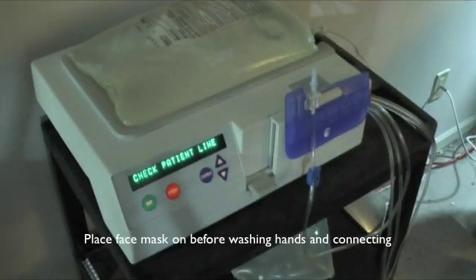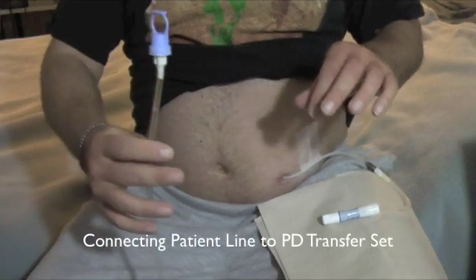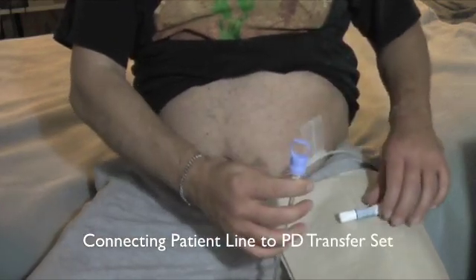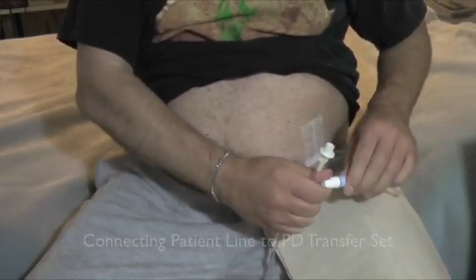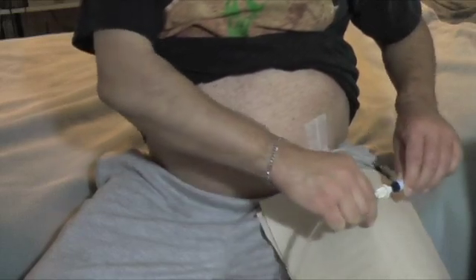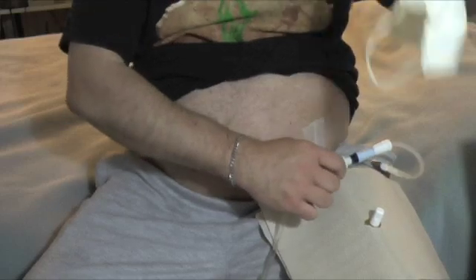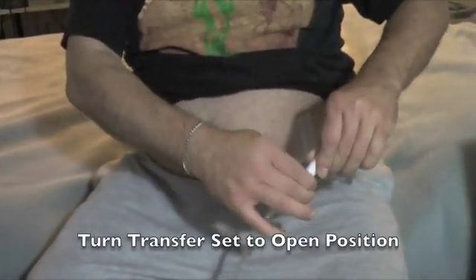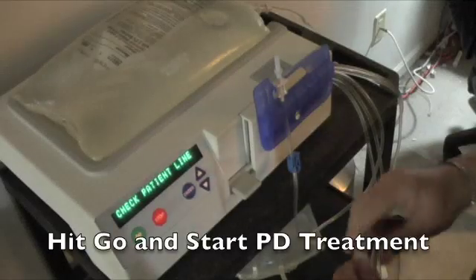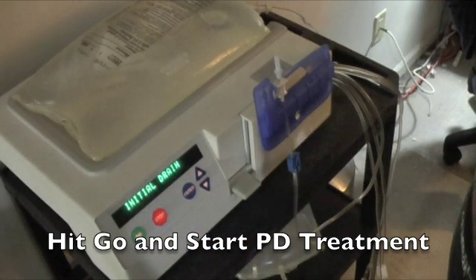Wearing my mask and after washing my hands, using proper antiseptic technique, I'm about to connect up. Here we go — that's the patient line and there's my transfer set. Being very careful not to touch the end of the line or the transfer set to anything while I connect them — just to each other. Now they're connected nice and tight. I take my mask off, turn the transfer set to the open position, hit go on the dialysis cycler machine, and peritoneal dialysis is about to start.